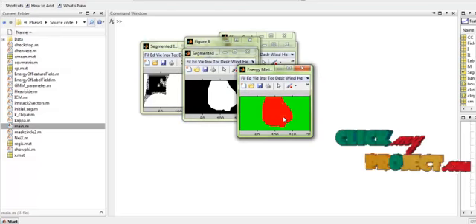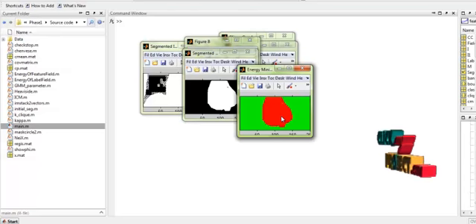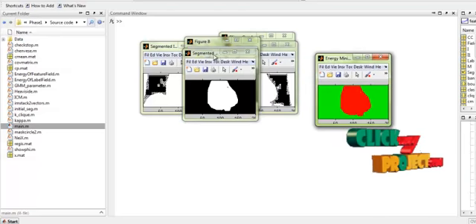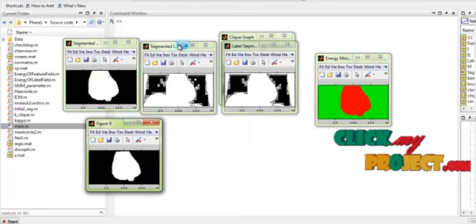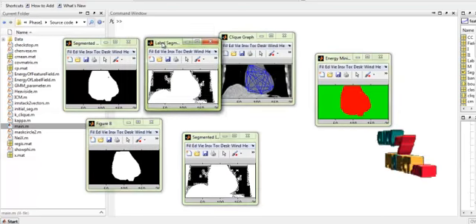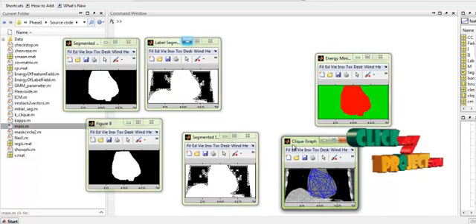Here we are representing the organ in one color and the background regions in another color. Thus, we have calculated the minimized energy segmented regions from the overall images. We have extracted exactly the organ regions, even though other regions were present in the input images.